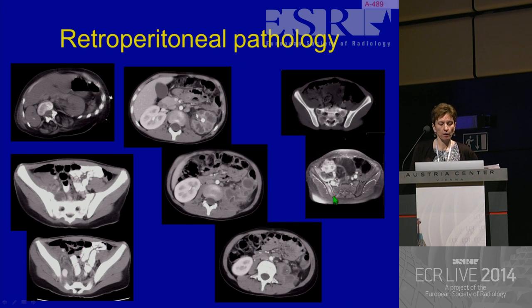Another case here, this time a sacroiliitis, with a sacral osteomyelitis, again with abscess formation. This child, as you can see, got both CT and MR. Both of these were adolescent patients. So psoas abscess, it's lovely if I can diagnose it on ultrasound, but particularly in older children, I can't always manage it. This case here is a child who perhaps could have appeared in the trauma section.